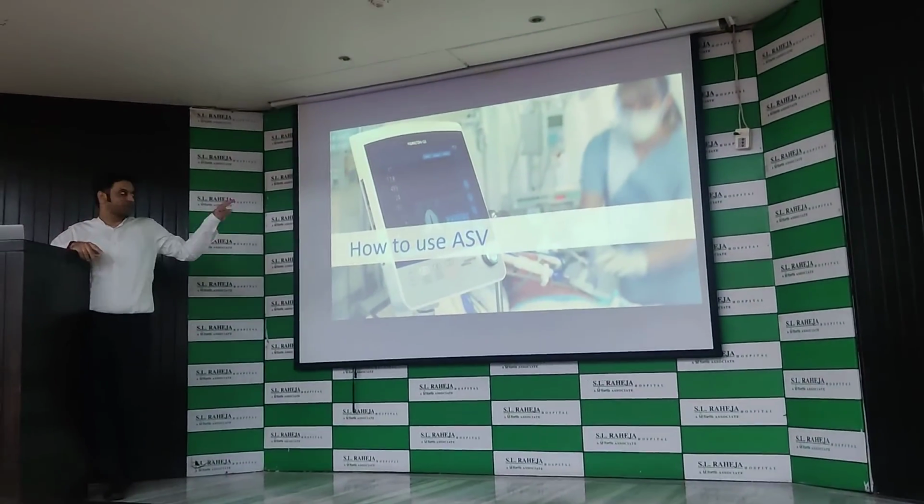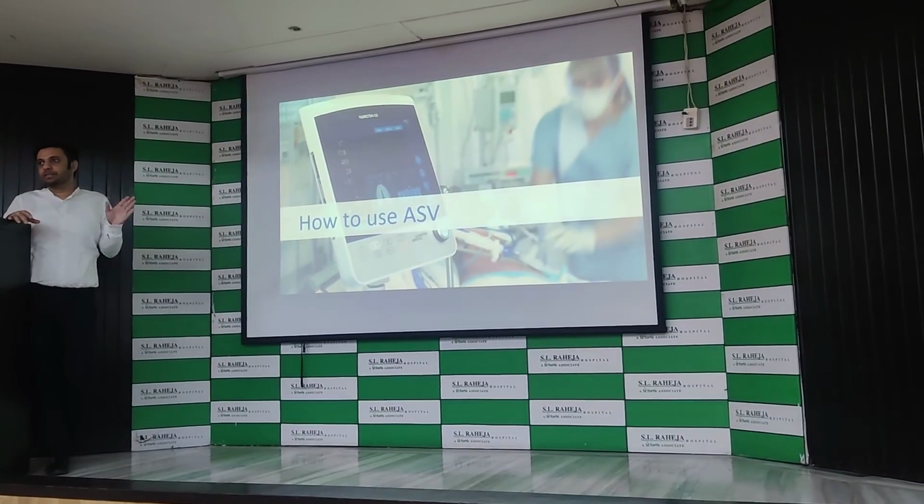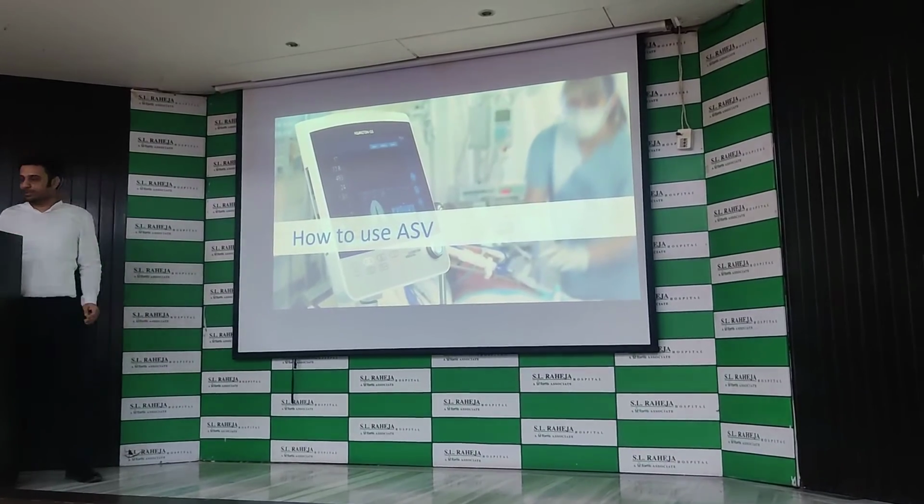But we have attached one for the normal lung patient in the ICU. So it always remained in the middle because it was a normal lung with no lung condition. So the entire time the safety box was at the same place.